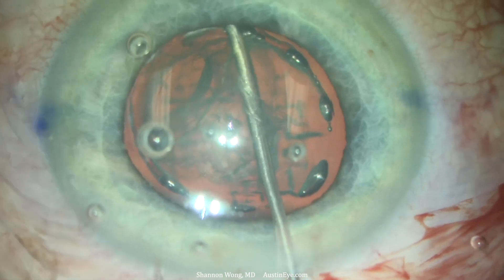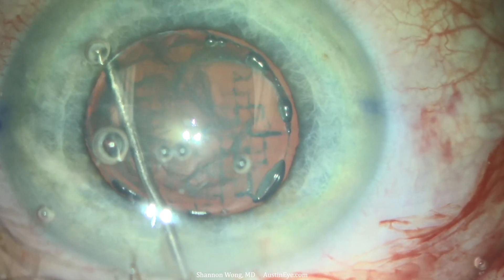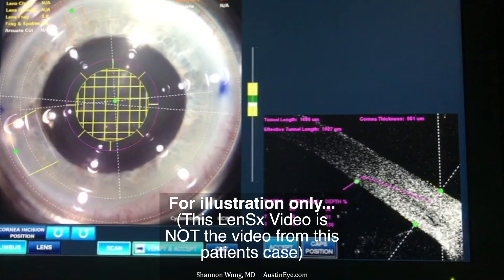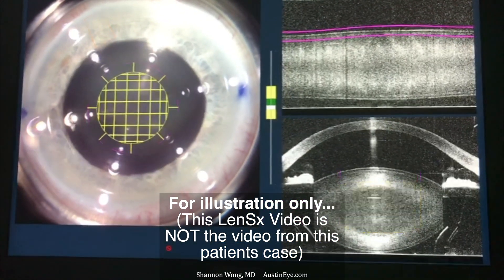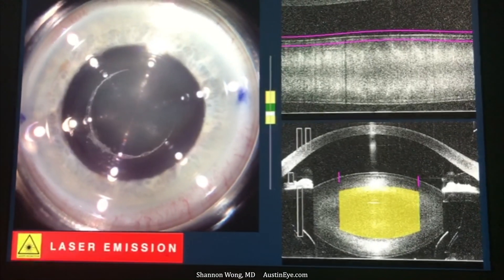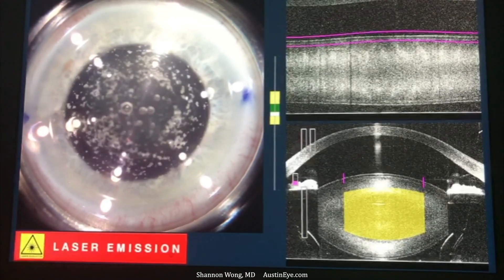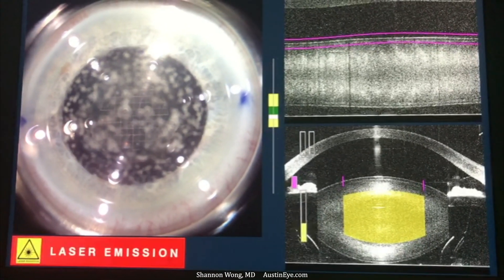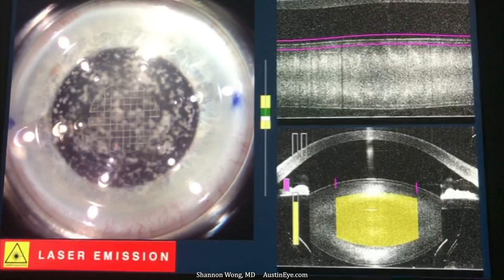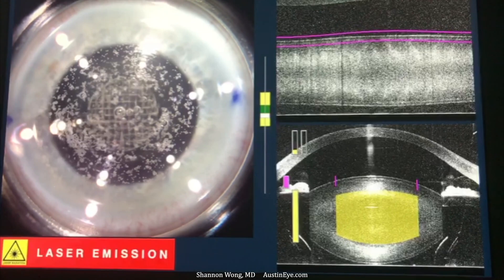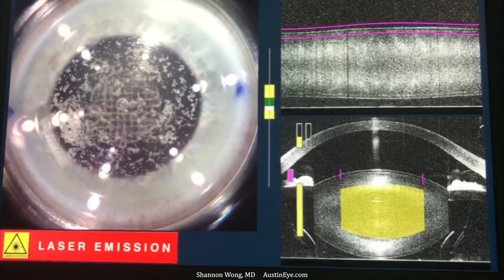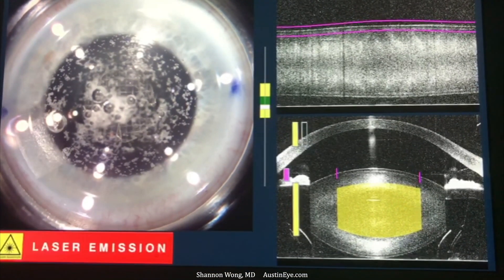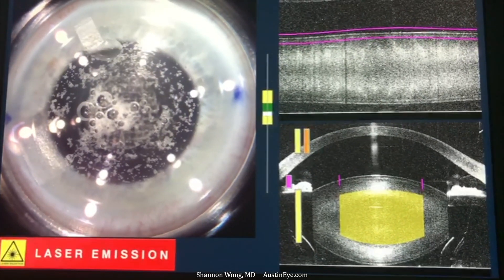Let's pause the video and explain what we observed during the femtosecond laser portion of the procedure. The docking and ablation went normally. The only unusual difference during the LensX laser application was that the primary corneal incision would typically be observable for about eight seconds on the monitor. In this case, the cornea incision was only visible for about three seconds. What probably happened was that the imaging of the femtosecond laser was more posterior than what was represented by the LensX imaging system — so normal bubble patterns appeared, but were being applied posterior to where the imaging system showed them to be.